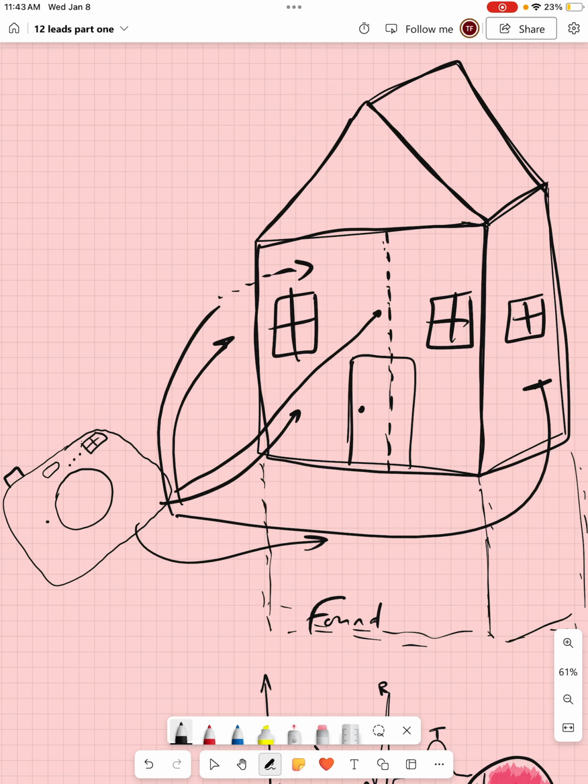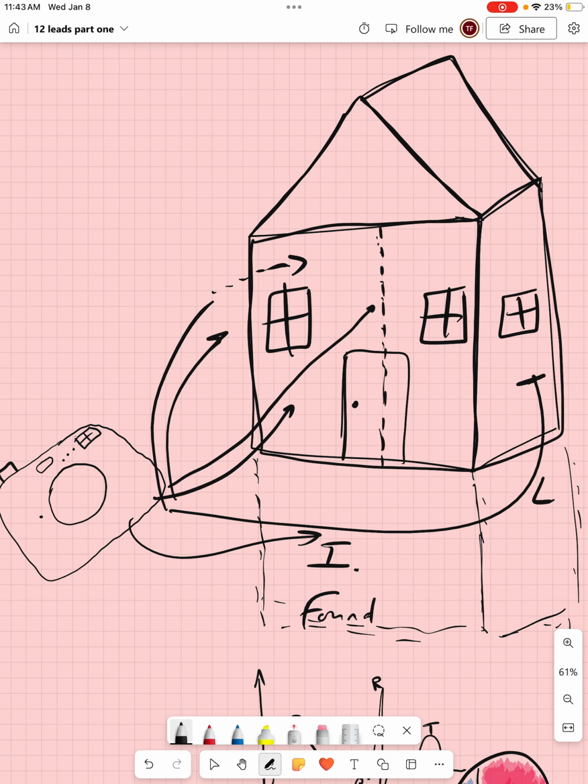And so just like this 12 lead, we are taking pictures of the inferior portion. We're taking pictures of the lateral portion, the anterior portion. Oh, I mixed up these, sorry. Anterior portion and our septal portion. And we could even look posteriorly. Again, going into different setups with lead placement, there is a way to check the posterior portion of the heart electronically. Generally set up like what we just reviewed, that is not it, but there are ways to do that.